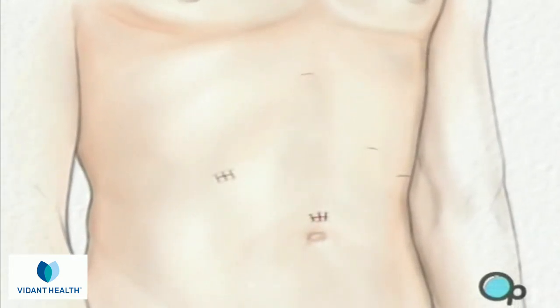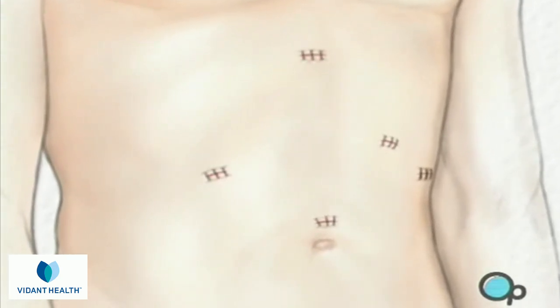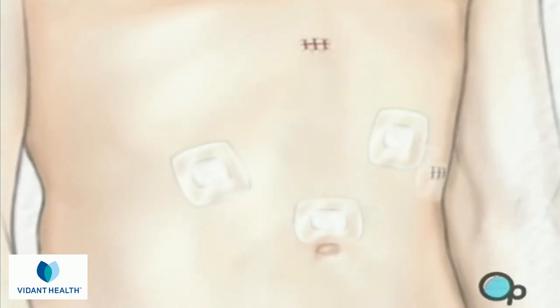The muscle layers and other tissues are sewn together, and the skin is closed with sutures or staples. Finally, sterile dressings are applied.